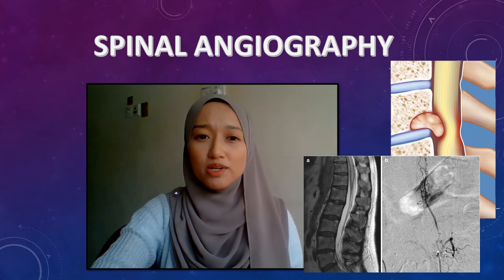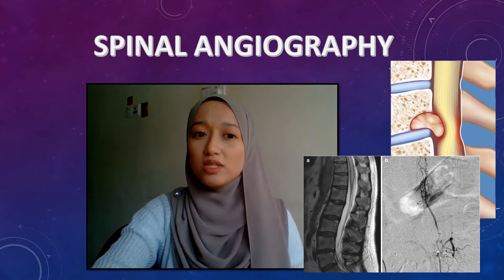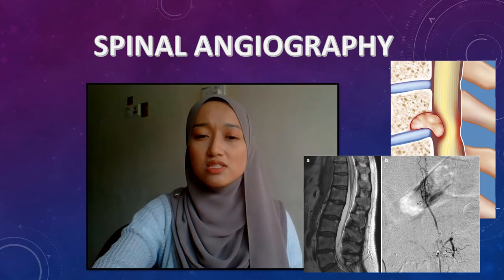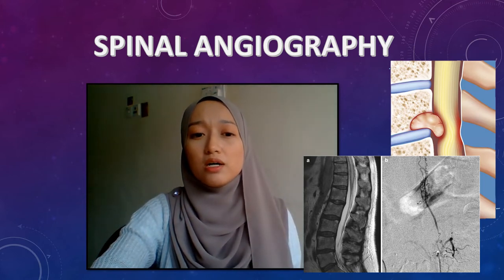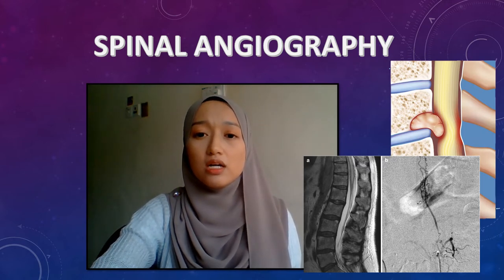Prior to the angiogram, your doctor will give specific instructions on how to prepare for the procedure, such as when you should stop eating and drinking, as well as discuss the potential risks and the benefits. There is always a small risk of complications such as bleeding or stroke, but in skilled hands, the benefits far outweigh the risks. A spinal angiogram is a minimally invasive procedure typically performed in an outpatient setting, that is, you will go home the same day as the test is conducted.